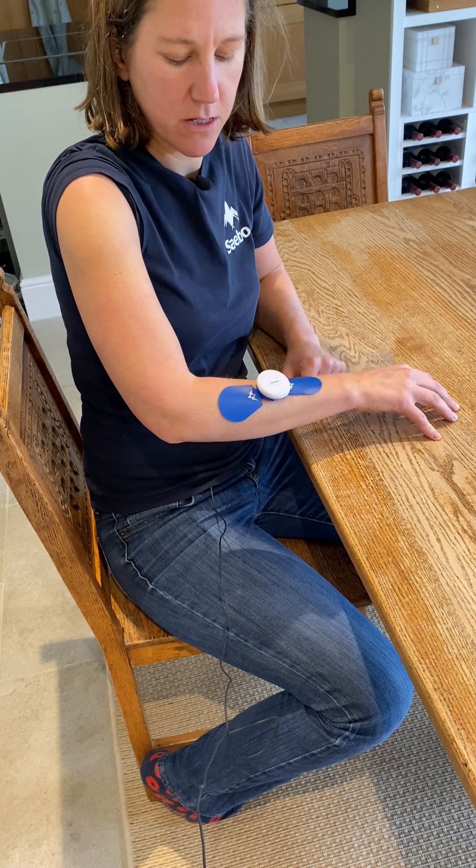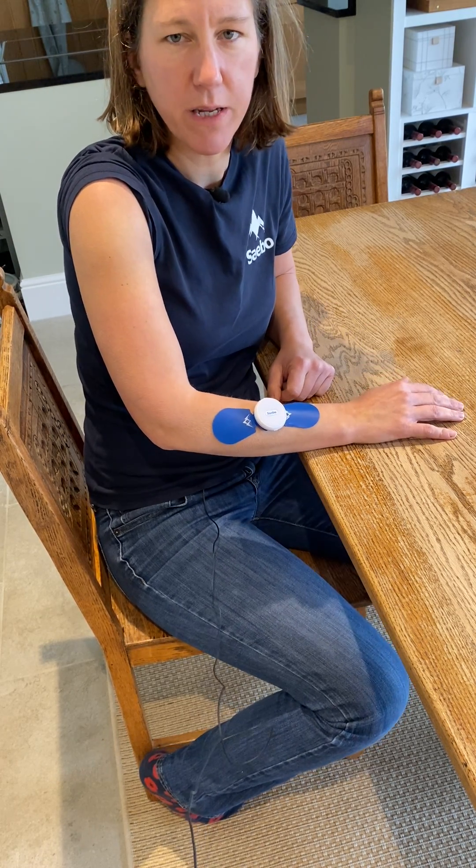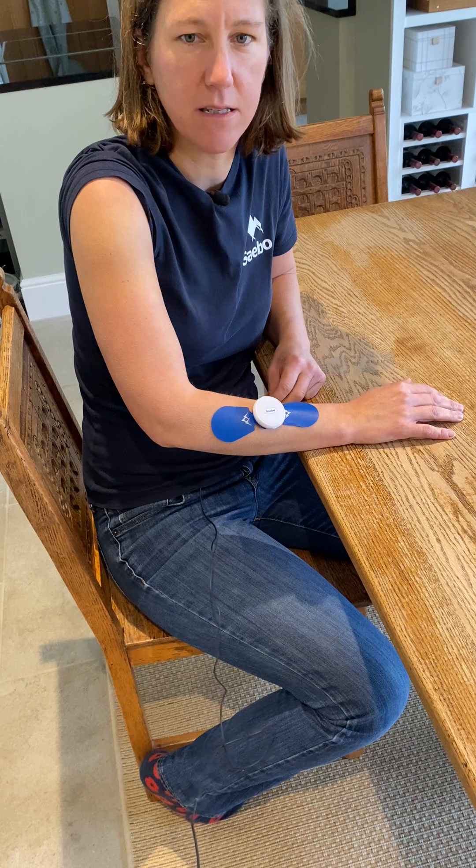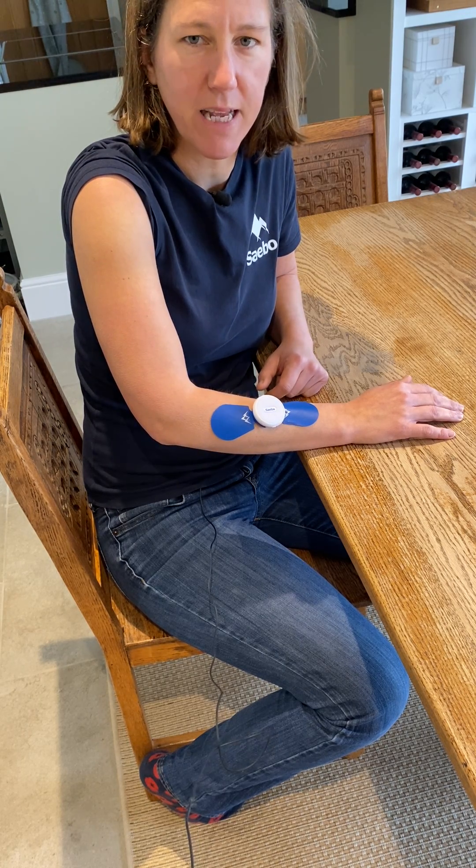Those are your three common placements. You can also check out photo pictures in the back of your manual and contact our clinical support team for any further advice, linked on our YouTube channel. Thank you.